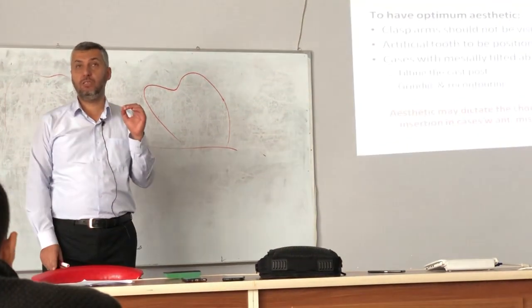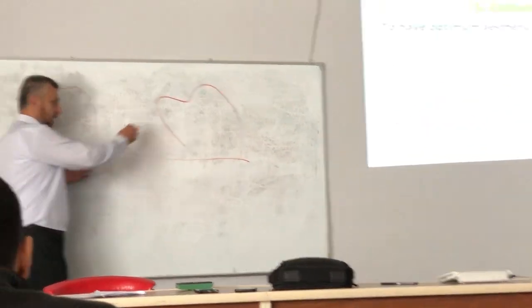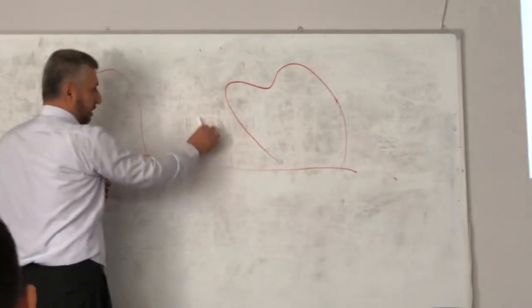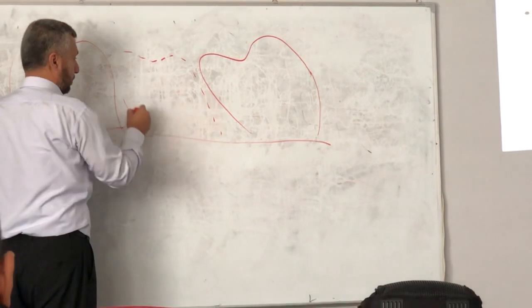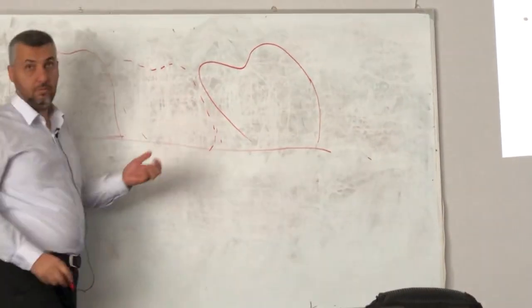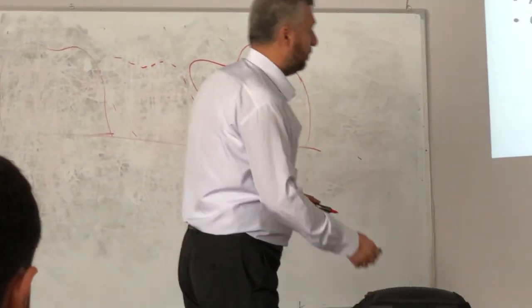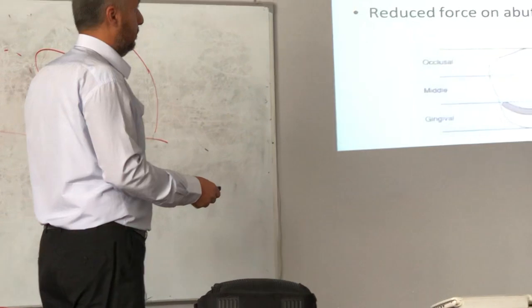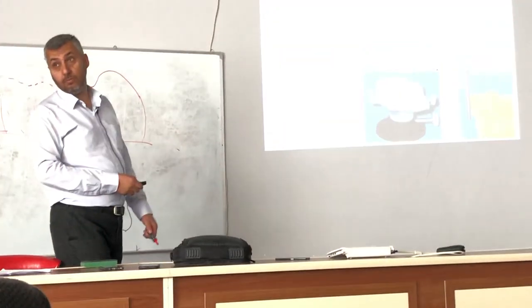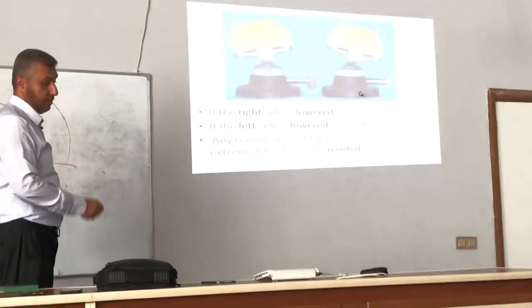What's the point of this? For example, if I tilt the cast, after that the tooth will be like this. This is the tilting.